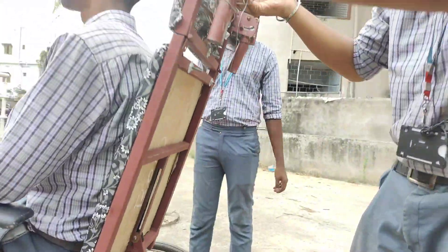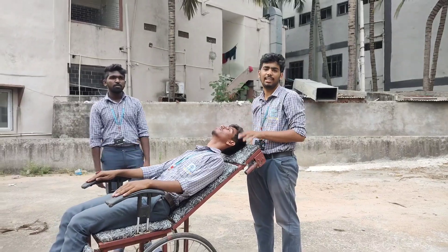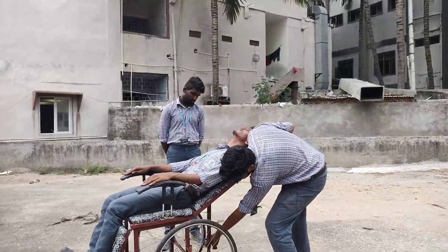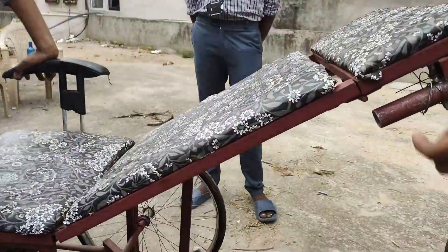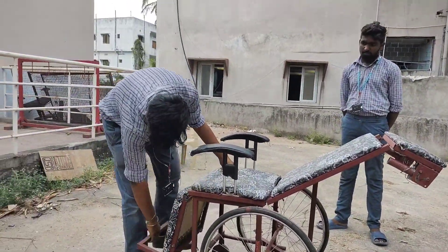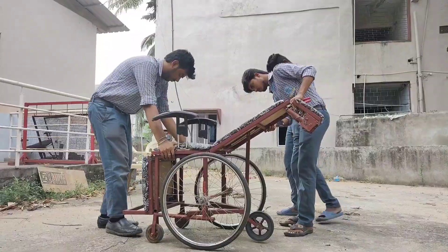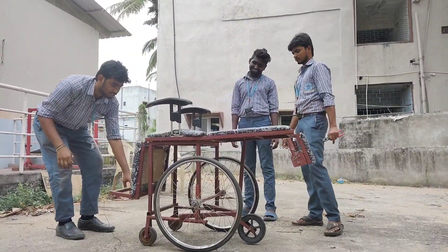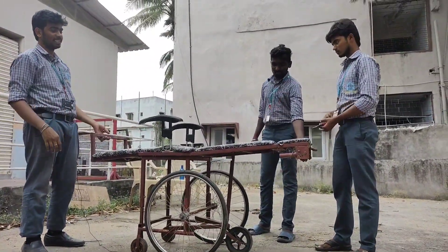When we loosen this linkage, the chair is converted into a semi-rest position so that the patient can completely rest on it. For full conversion to a stretcher, he has to lift the lever. This is the normal stretcher height so that the patient can completely rest on it.